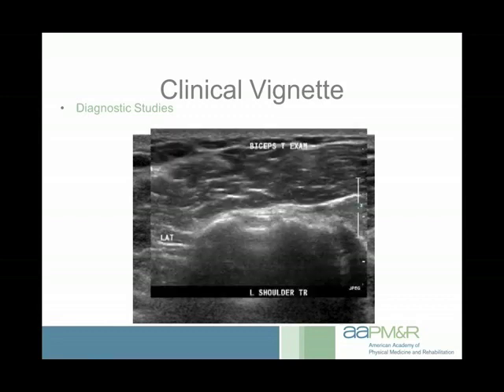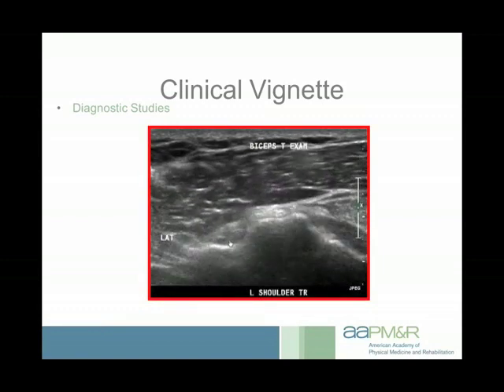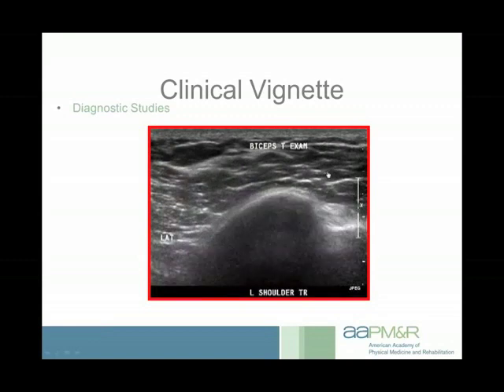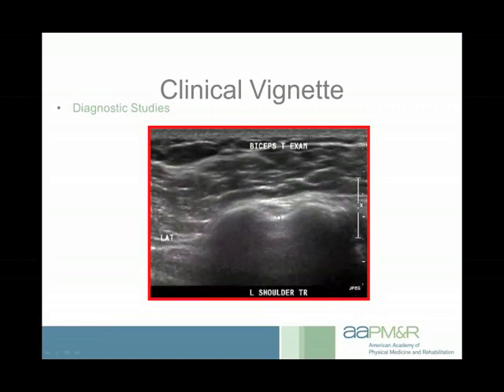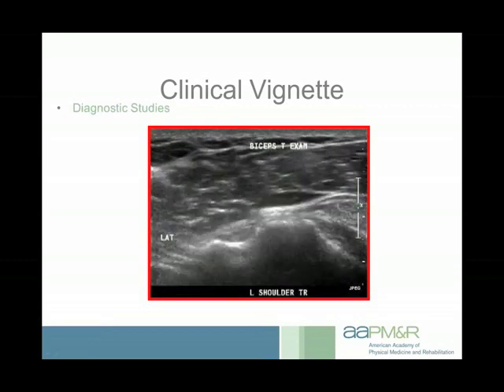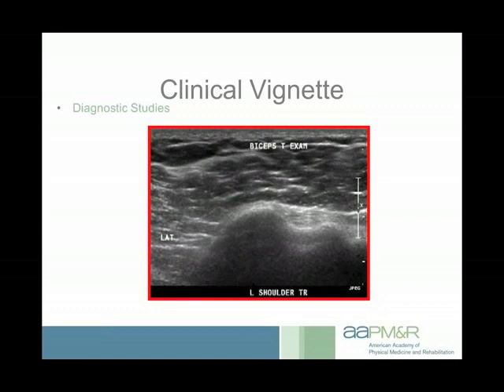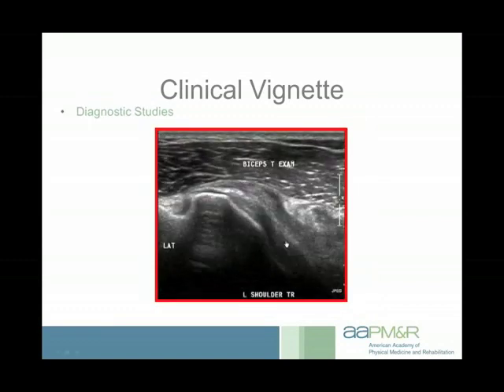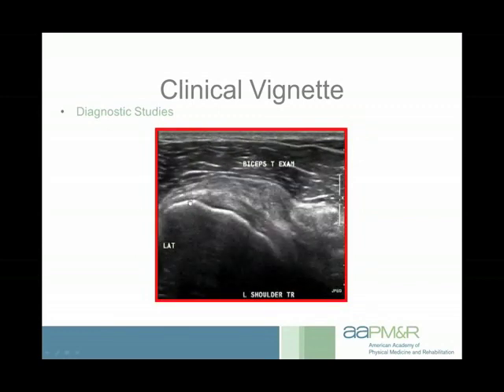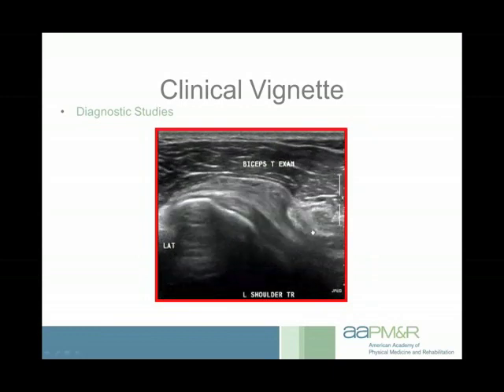I performed a dynamic examination, moving from internally to externally rotated position, watching the biceps tendon specifically to see if it would dislocate. The biceps tendon stayed nicely centered in the groove — no evidence of subluxation or dislocation. Despite that, while doing this examination I could feel a snap. So something was snapping, but it wasn't the biceps tendon. I then moved the ultrasound probe just medial to the biceps tendon. Here's the biceps tendon, the lesser tuberosity, and the subscapularis tendon — and right over the top of that, you can see this tissue snapping back and forth underneath a tissue bundle.